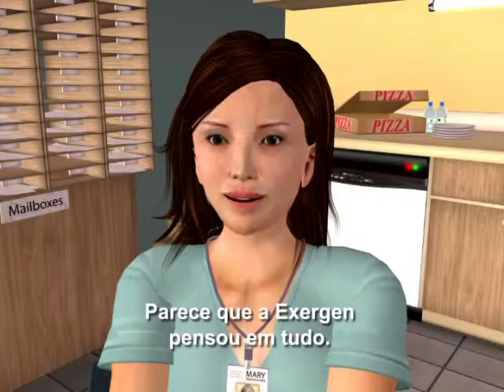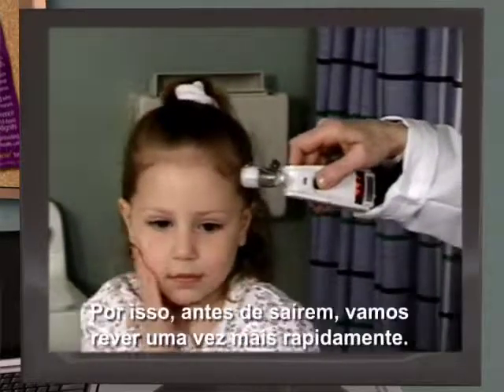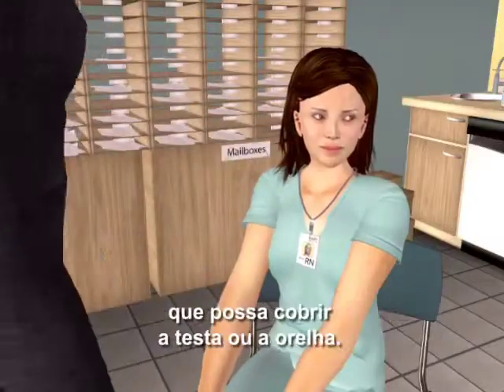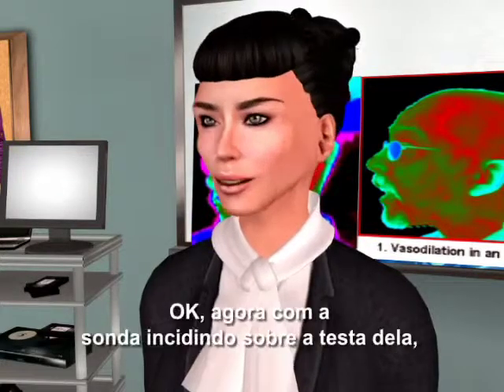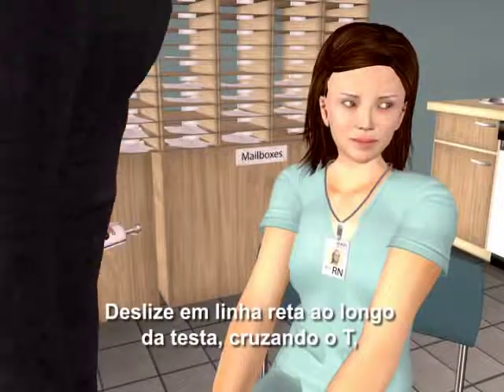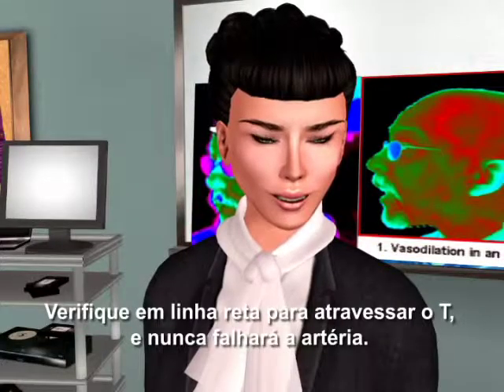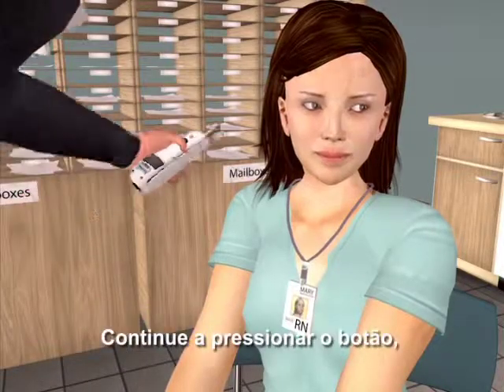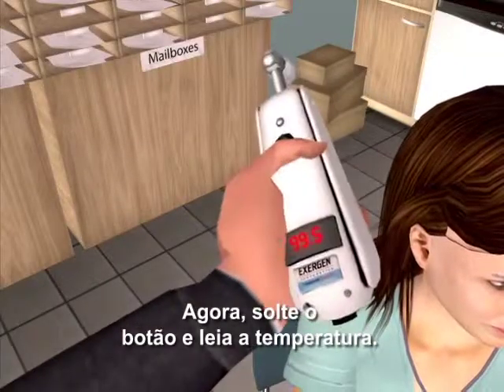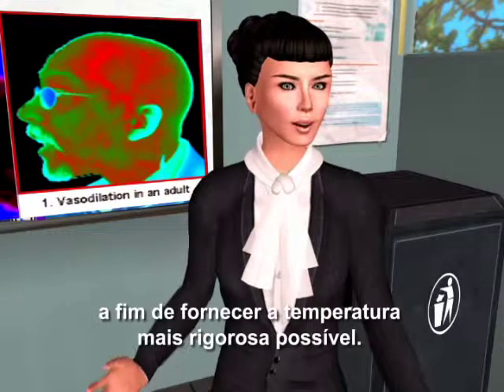It looks as if Exergen has thought of everything. The most important thing to take away from this training is proper technique. After wiping the probe head, brush away any hair or anything else covering the forehead or the ear. With the probe flush on the forehead, depress the button and keep it depressed until you are done. Slide straight across the forehead, crossing the T's — not down the side of the face. Continue to hold the button down, touch the neck behind the earlobe — the perfume spot — then let go of the button and read the temperature. The temporal scanner pinpoints the highest of 3,000 temperatures to provide the most accurate temperature possible.